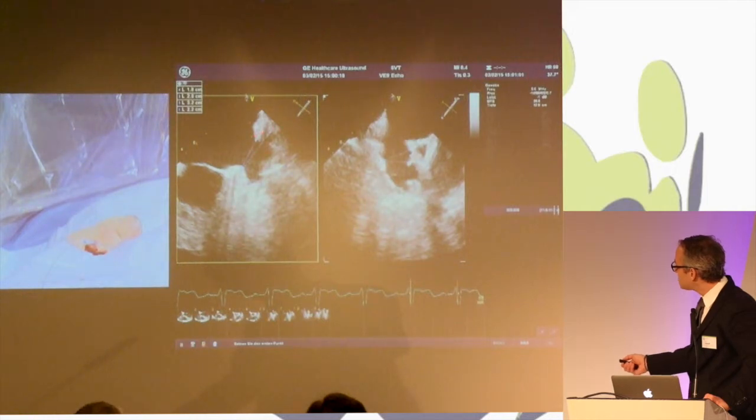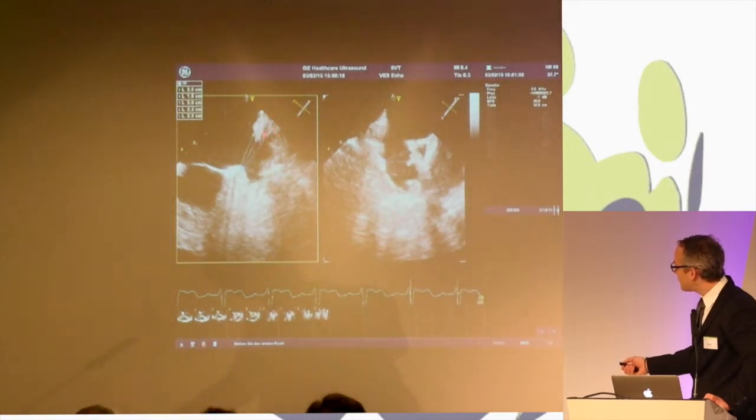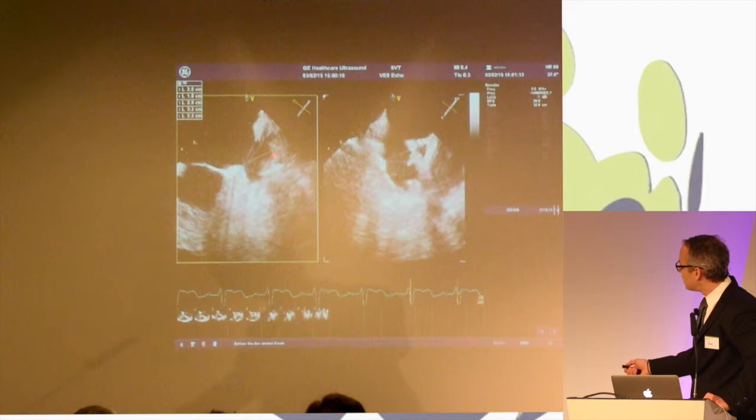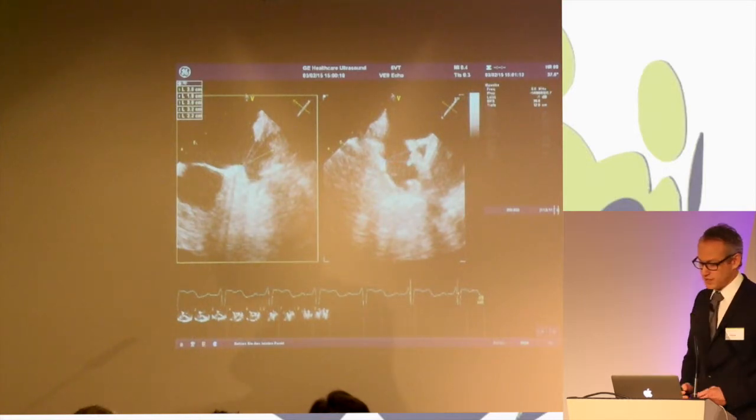We have a lobe here, which is maybe a recessus or maybe something else. At least it causes a very wide diameter of 32 millimeters. And then we are measuring a third line in this angulation, a little more distal. And on the corresponding images, we also have two lines. One is more proximal and one is more distal here.